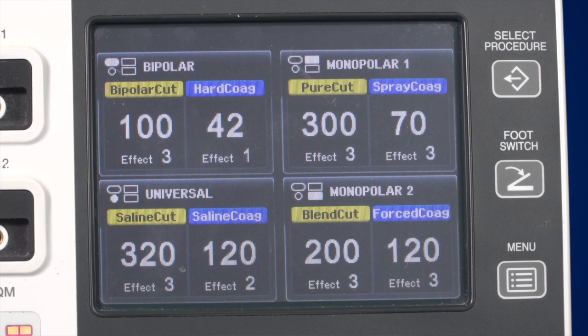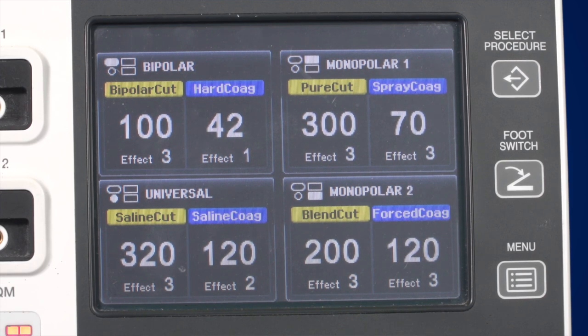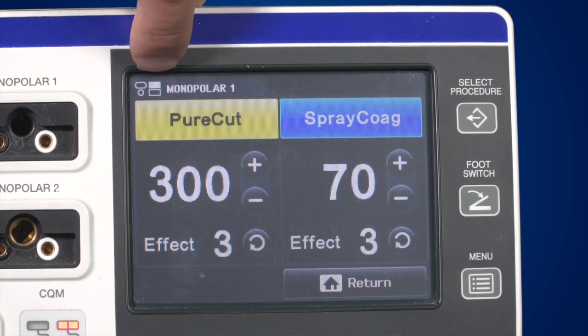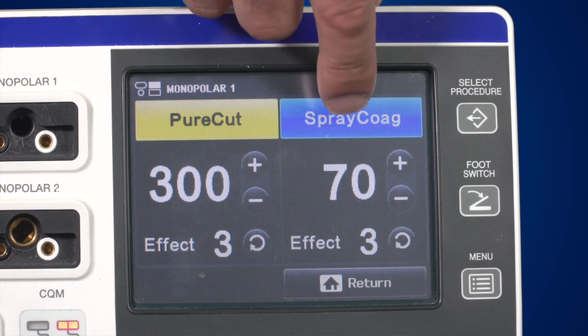The graphical user interface has three different display layers. The first layer, or All Screens, shows all connector settings and allows you to change the settings. A single screen can be selected by opening the corresponding window — it only shows the settings of the selected connection area. For example, selecting the Monopolar 1 button lets you see and change its settings, including a description, a symbol for the connector socket, a yellow cut field, and a blue coagulation field.